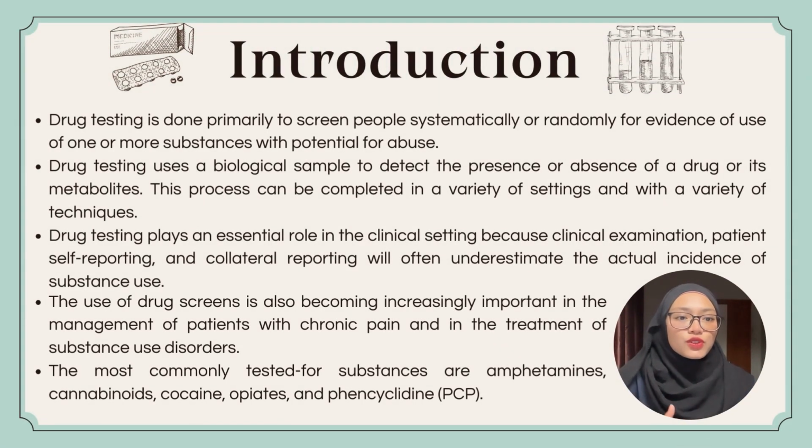Drug testing is done primarily to screen people systematically or randomly for evidence of use of one or more substances with potential for abuse. Drug testing uses a biological sample to detect the presence or absence of a drug or its metabolites. This process can be completed in a variety of settings and with a variety of techniques.